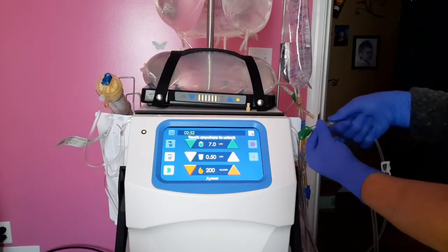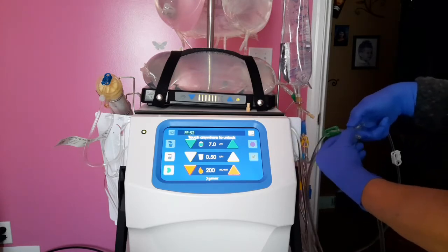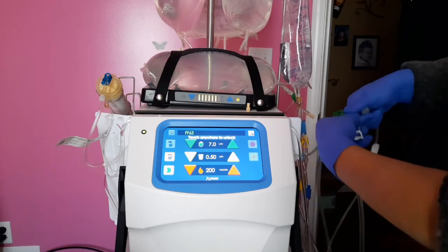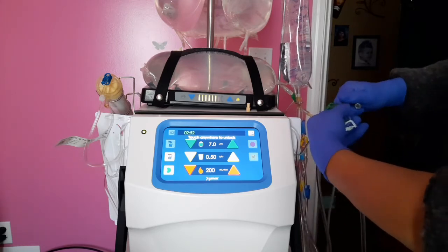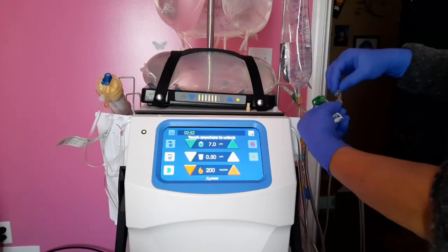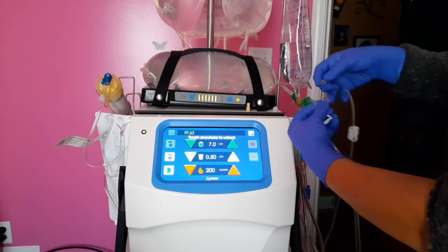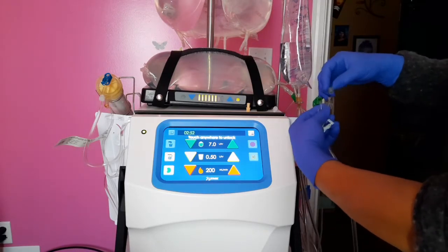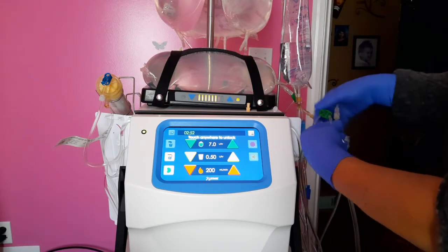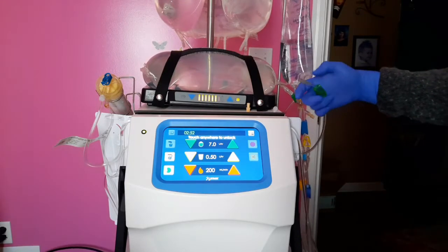So hold on to the wing, turn to the left, and disconnect the cap from the saline T. Connect white to white, as soon as I can see. Okay, screw that on there, make sure it's nice and tight. Okay, drop the lines, you're done with that.